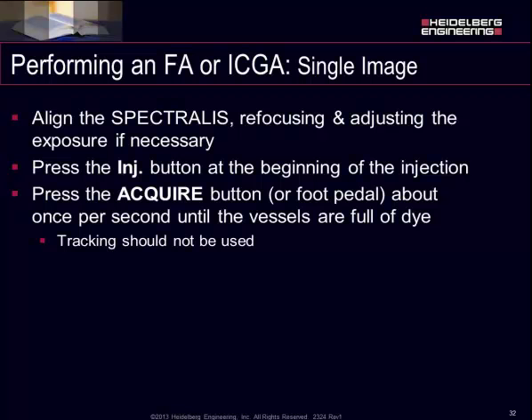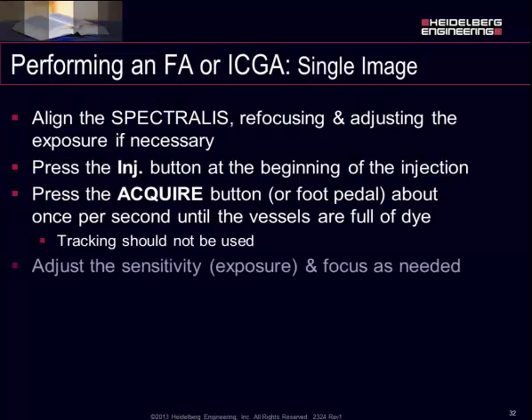Using this method, you do not want to use tracking during the transit. Because things happen so fast, you don't want to miss anything by using the tracking. And again, you want to adjust the sensitivity knob and the focus if needed.